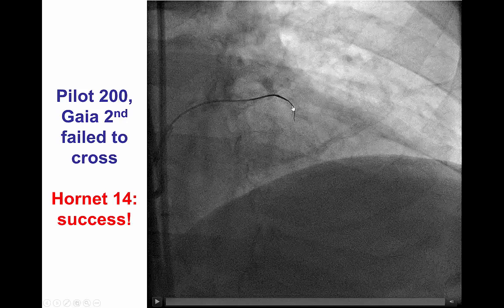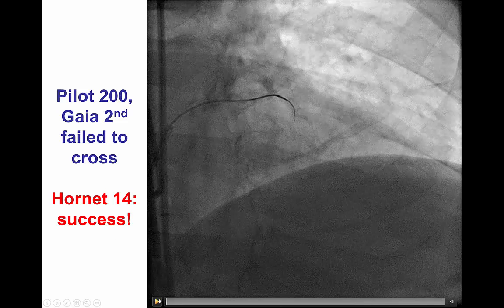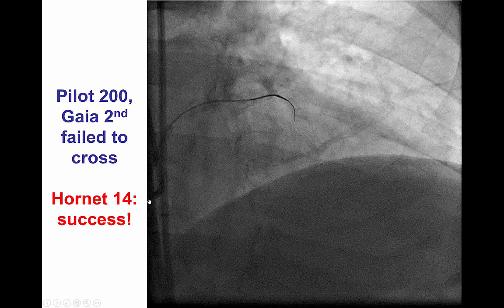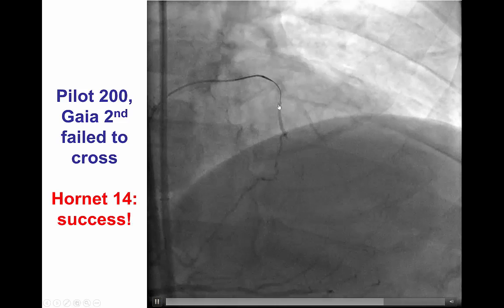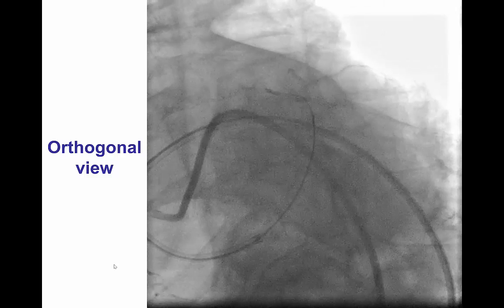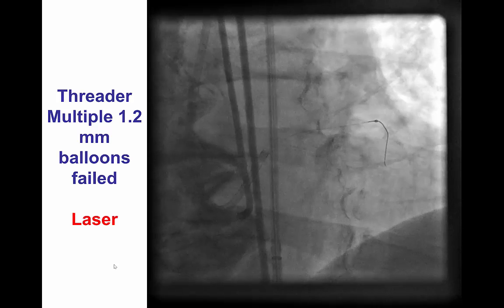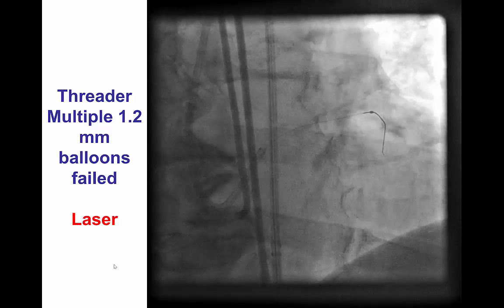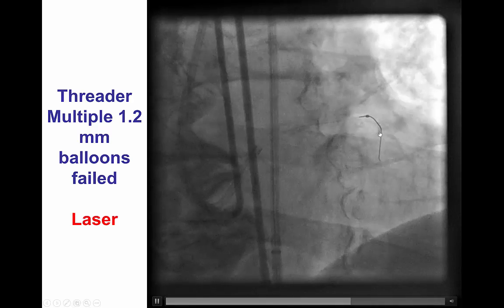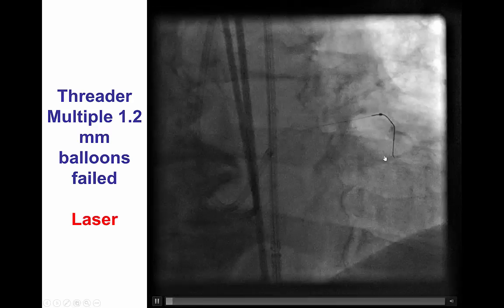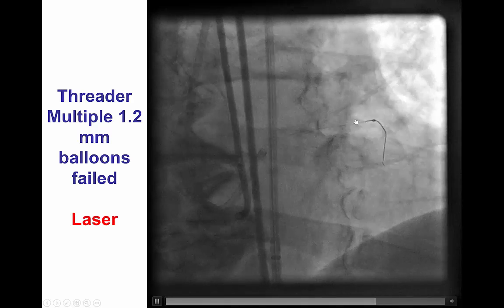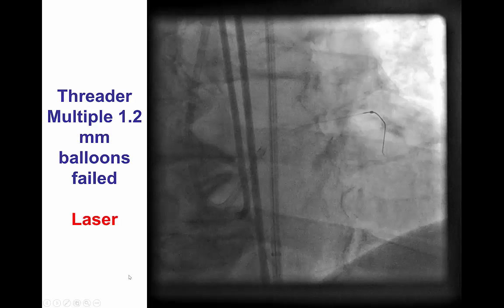A Corsair catheter was advanced to the proximal cap and escalation was performed using the Pilot-200 and the GAIA-2 guide wire. However, those could not cross. A Hornet-14 guide wire did cross into a septal branch connecting with the epicardial collateral, confirmed in an orthogonal view. However, when a balloon was attempted through the occlusion, it could not be advanced. This is therefore a balloon uncrossable lesion.